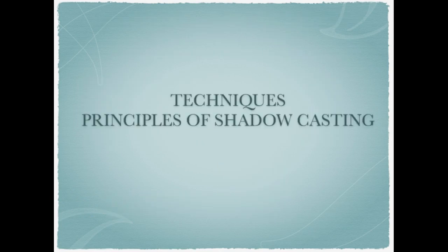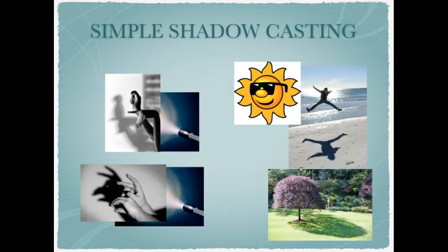Now let's look at some techniques which are principles of shadow casting. Simple shadow casting: perhaps you've seen people do shadow puppets. This is actually an example of shadow casting, which we're going to see, as dental x-rays actually cast a shadow onto an image receptor.